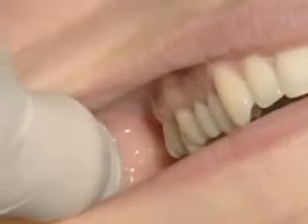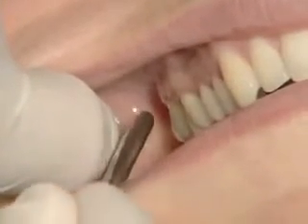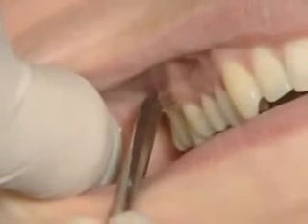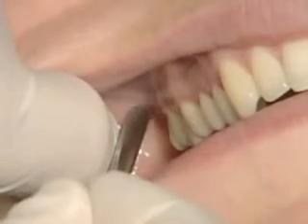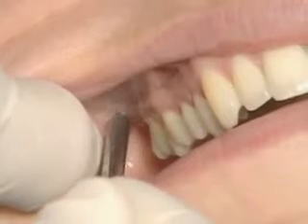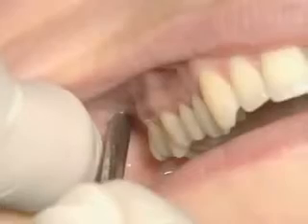For this block, you begin by palpating the intraoral landmarks with the mouth just slightly open. I begin by feeling the coronoid process, and my finger is now resting on the coronoid process. The point of insertion is against that posterior wall of tissue. The height of insertion is shown by the mucogingival junction of the maxillary gingiva, and you draw the line back towards that posterior wall. In the lateral to medial plane, the medial border is the maxillary tuberosity, the lateral border is the tendon of temporalis, and the final insertion point is right in between the two. This represents the final insertion point for the Akinosi closed-mouth technique.